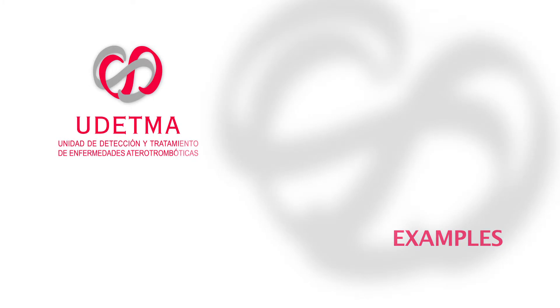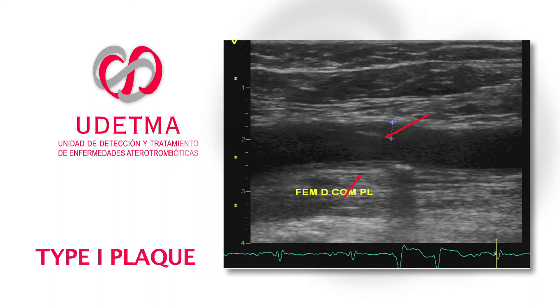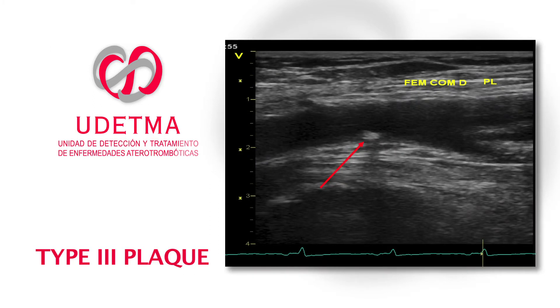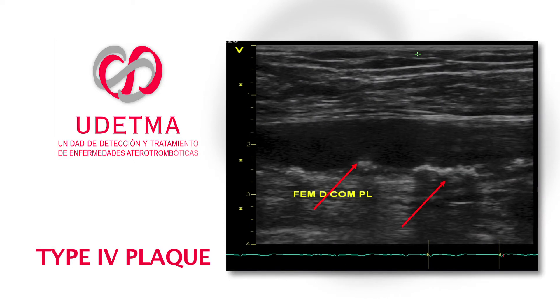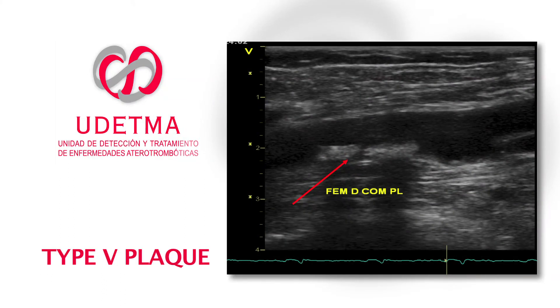Examples: Type 1 plaque – concentric type 1 plaque on the common femoral artery. Type 2 plaque on the posterior wall of the common femoral artery. Type 3 plaque on the posterior wall of the common femoral artery. Type 4 plaque on the posterior wall of the common femoral artery. Type 5 plaque on the posterior wall of the common femoral artery.